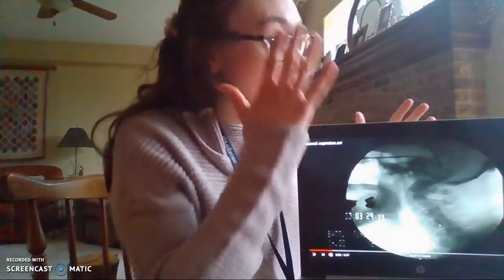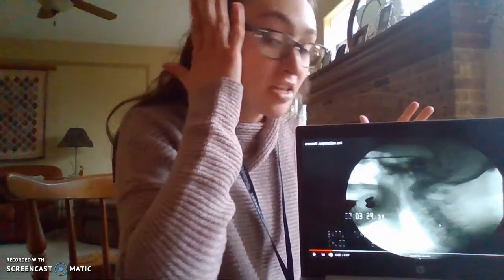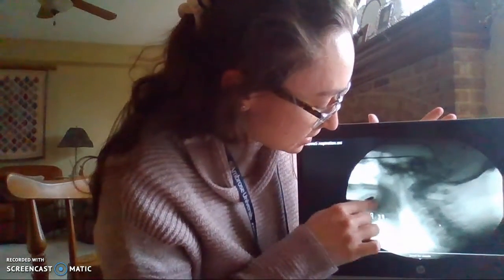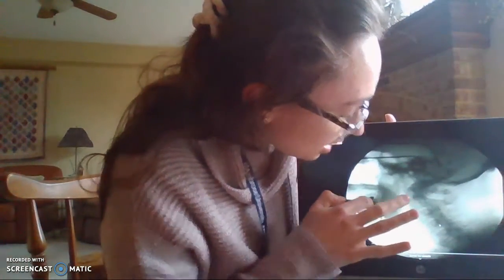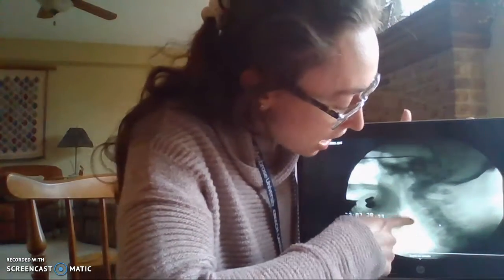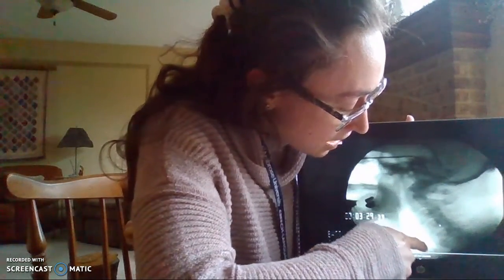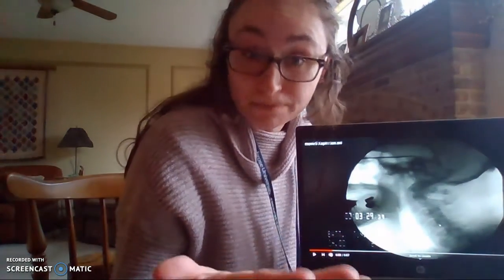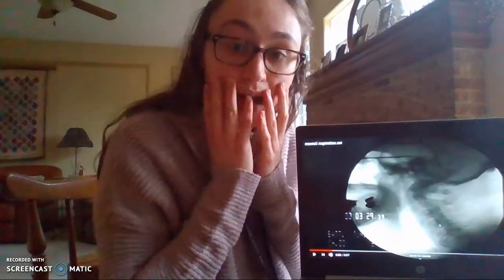This is the lateral view, the side of your face and your throat. Here's your oral cavity. We can see your teeth, your tongue, and then we're going to look back here into the pharynx or the throat, and you'll see the esophagus. I'll show you a little later, but that's your tube. It's a collapsed tube that opens up during your swallow, and the food ideally goes down from your oral cavity.